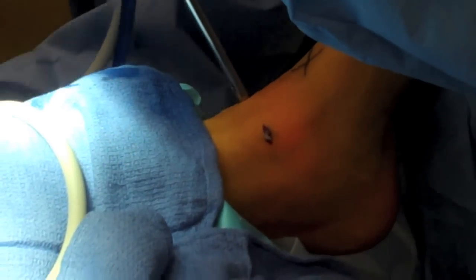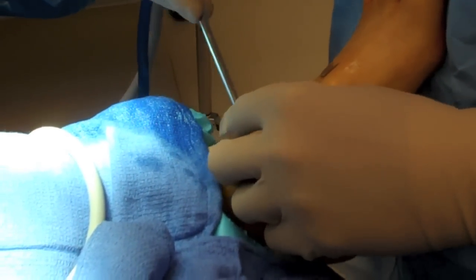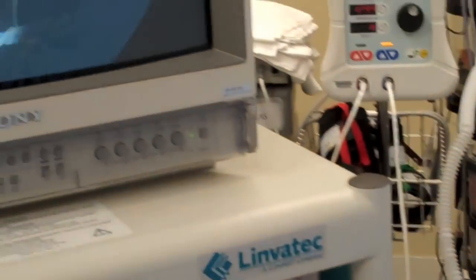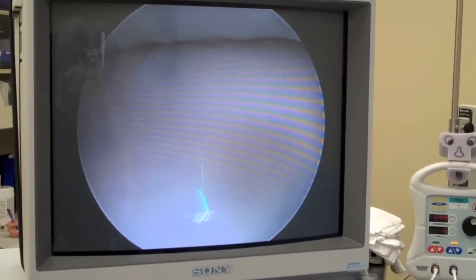The joint is isolated. Proper flow of ingress is important to distend the ankle joint and allow visualization of the joint. Once the arthroscope is well established within the joint, the egress portal is established. You can see the central aspect of the joint with the tibia in the upward position and the talus in the downward position. Here we have a good view of the ankle joint itself.